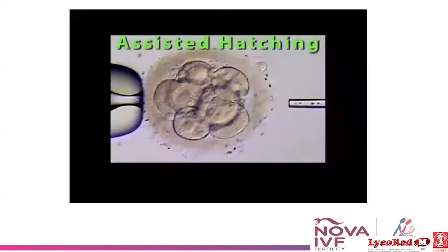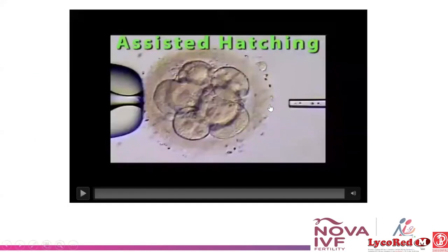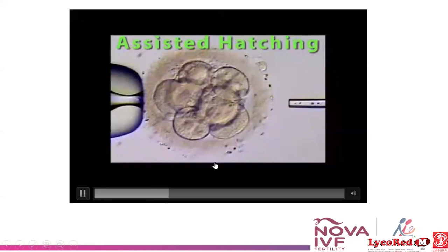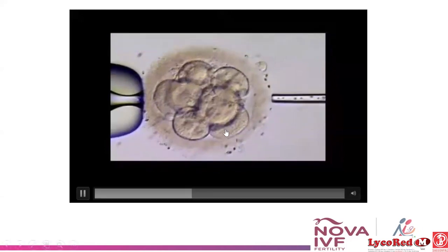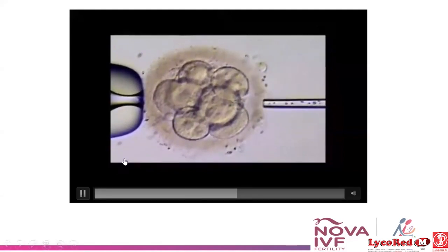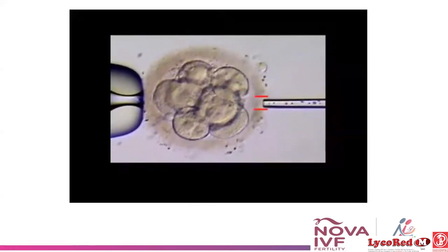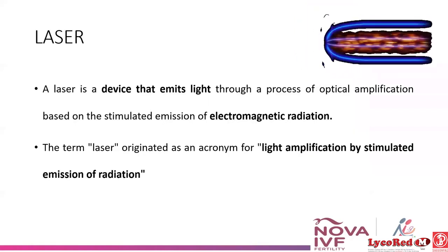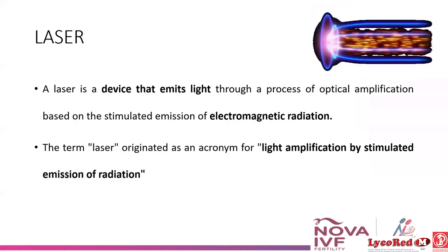But I will just give you one video of how they use the acid Tyrode's method. You can see here in this video. So you have seen how the acid Tyrode's is dissolving the zona pellucida, and we enter inside the embryo.